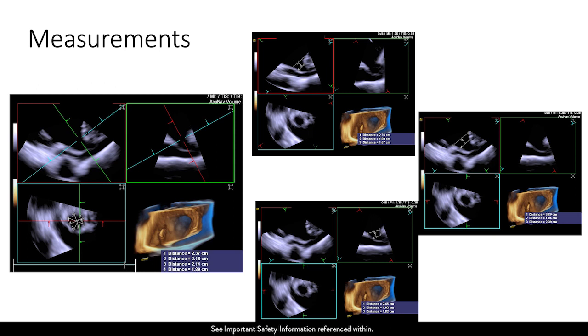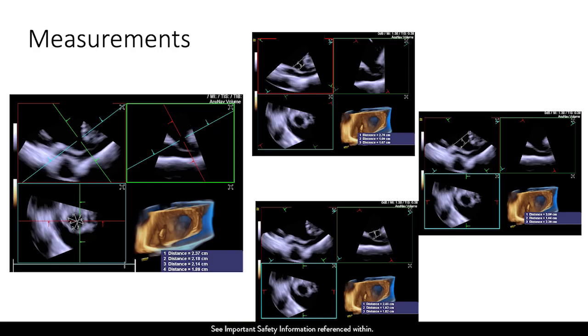Okay, so some of the measurements that we do using the MPR technique, you can see, you can measure the antrum out here. I have to tell you that there was a TEE present, but we have blinded ourselves to the TEE pictures, so we're not looking at it. We're just using 3D intracardiac echo. And these are some examples of measurements that we got, which have been taught much more extensively before, so I'll jump on to the next one.